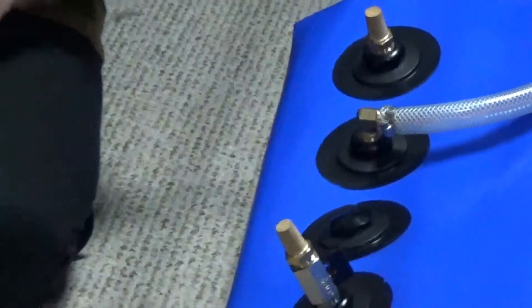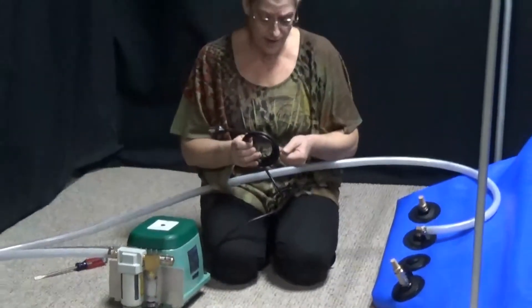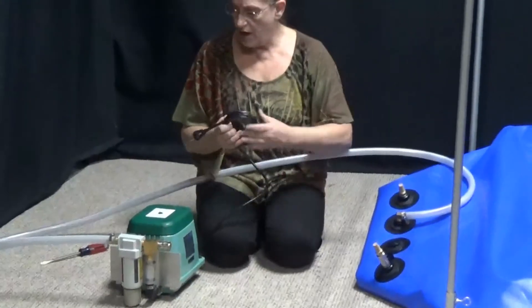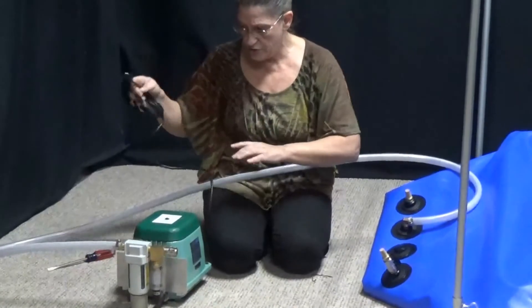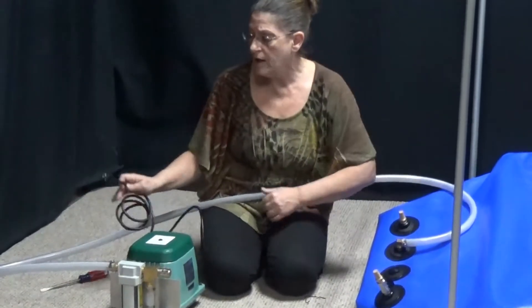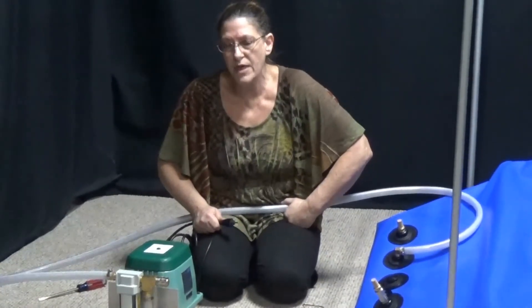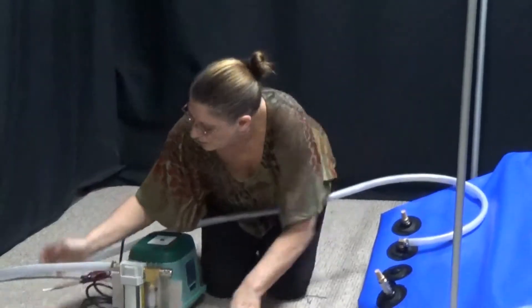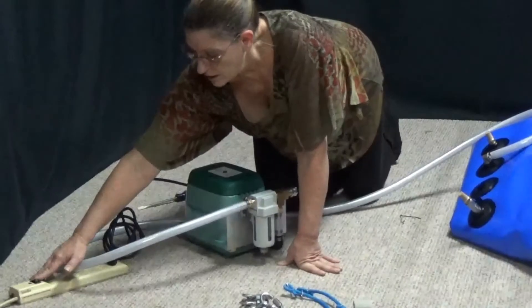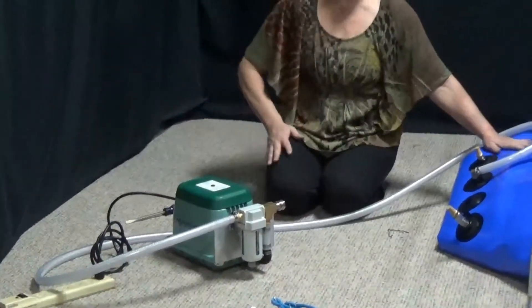Now for the compressor, this does not have an on-off switch — it plugs in and unplugs to turn it on and off. At my house I've got mine going into a power strip, so the compressor is okay to have going into a power strip. You do not want your oxygen concentrator in a power strip — that item you want to plug directly into the wall. So we'll go ahead and plug that in, switch that on, and our chamber is starting to inflate.